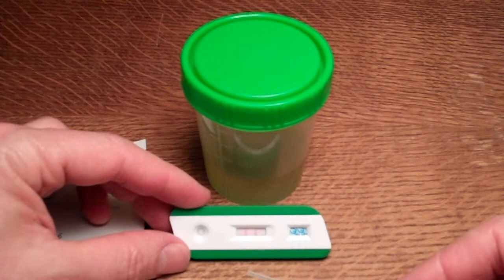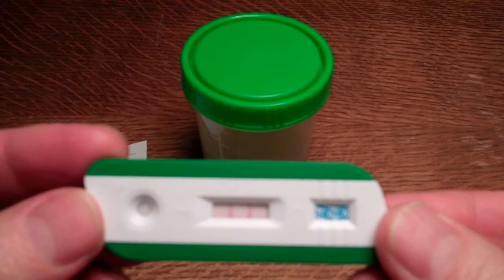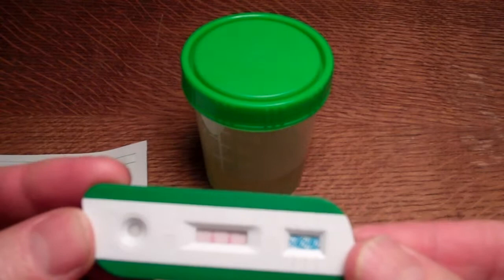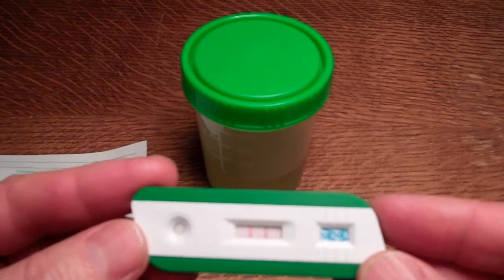If I bring the cassette closer to the camera, you'll hopefully be able to see the clear two lines forming on this cassette THC test, indicating a negative test result. In positive test results, you will get a control line forming at the C end but no test line forming, and you must allow a full 10 minutes development time to read the test.